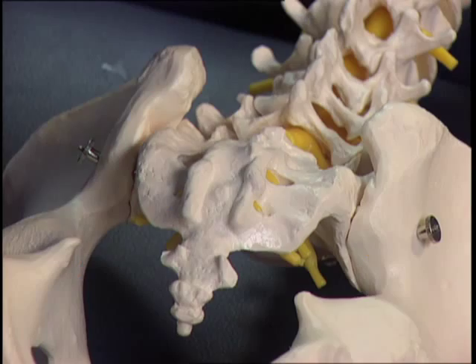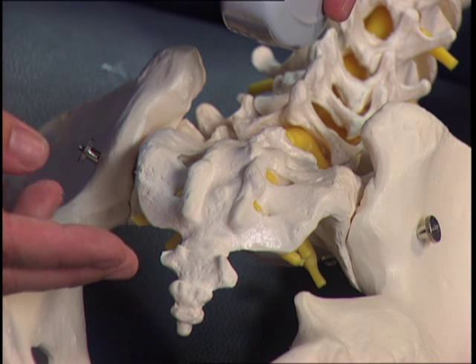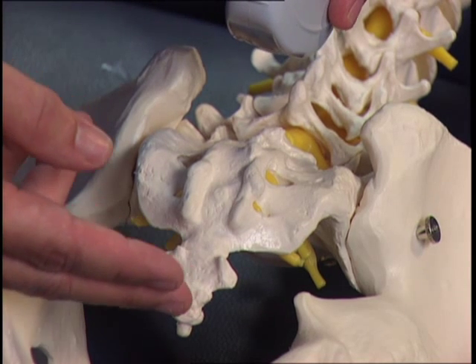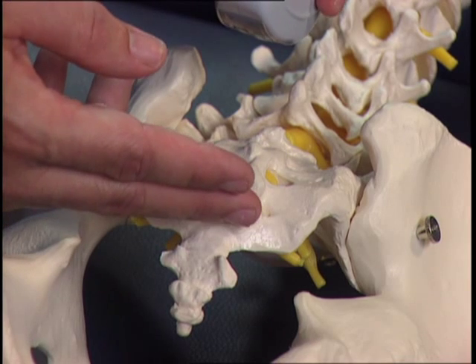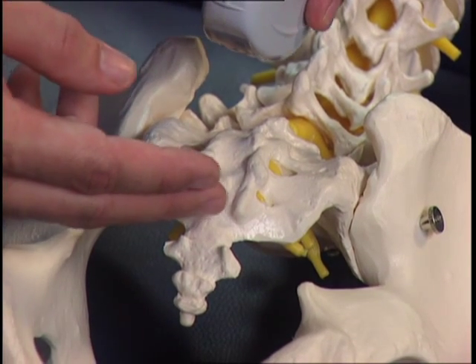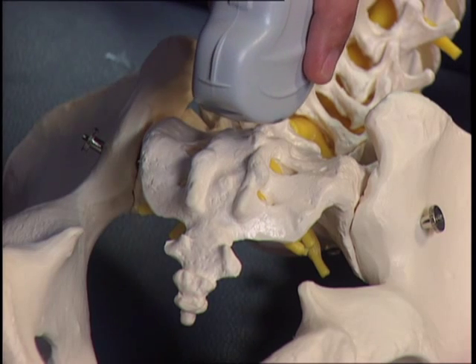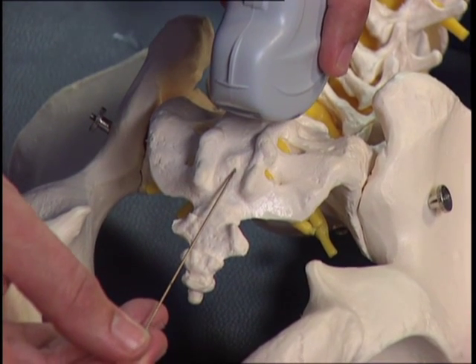Today I'm going to demonstrate a caudal epidural steroid injection. This is a variation on the technique of a lumbar epidural steroid injection. With the probe in this location, we can see the following anatomic structures: the coccyx, the sacrococcygeal ligament, and the sacral cornu. This indicates the entry at the sacral hiatus. The needle is placed thusly, performing the block.